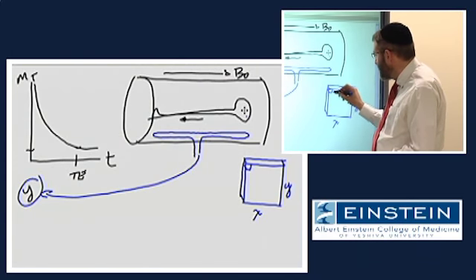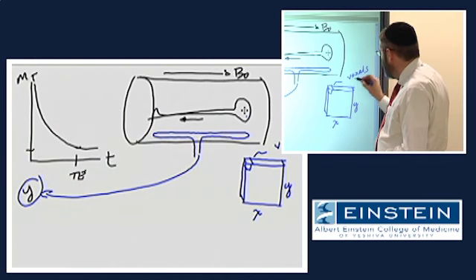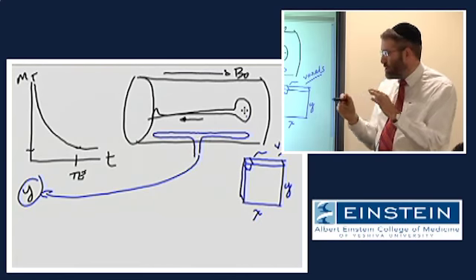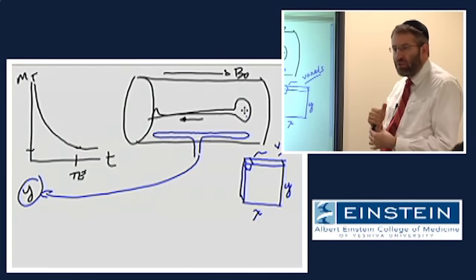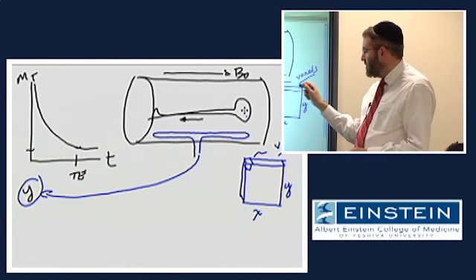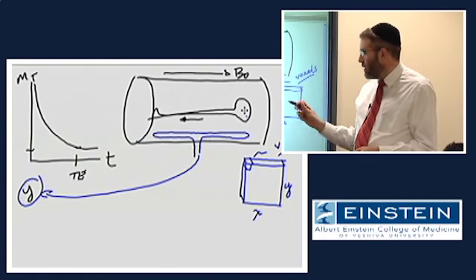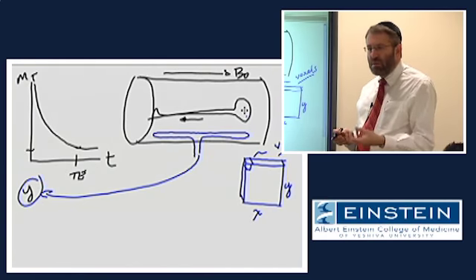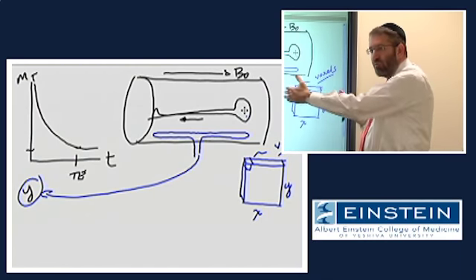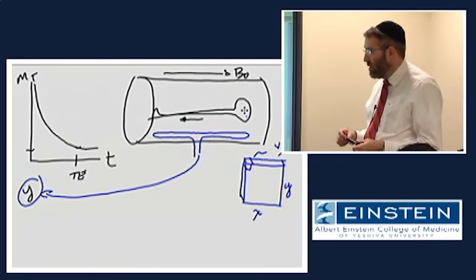And each of these pixels that we're talking about, we actually call voxels, for volume elements, because they're not just a representation of some 2D location, but they actually are some 3D chunk of tissue. So what we're looking to do is to generate an image like this, which is a two-dimensional array of a bunch of little prisms, each one containing information about some volume of tissue. And of course, the size of these voxels and the number that we have arrayed across the dimensions of the image is going to determine the spatial resolution of our image.